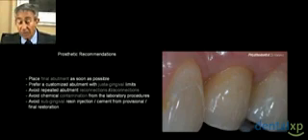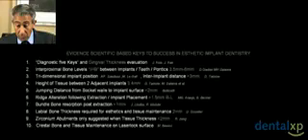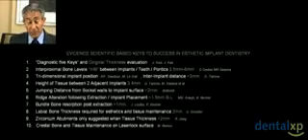There are some prosthetic recommendations. It's better to have a customized abutment with the margin juxta-gingival or just 0.5 millimeter from the gingival margin, so there will not be any cement trapped inside, which would be a complication. Don't forget to decontaminate any product coming from the lab, and maintenance of the patient is very important. This patient should be considered as a normal patient and should come for maintenance on a regular basis, because inflammation is part also of the recession.